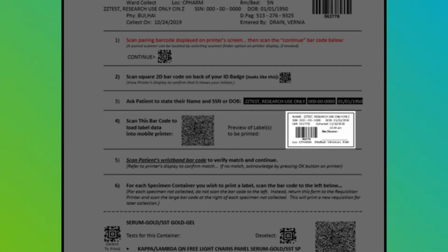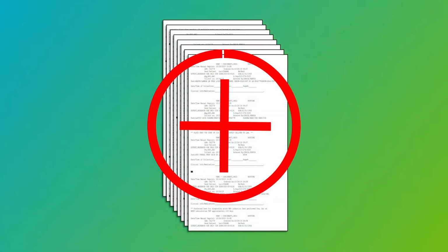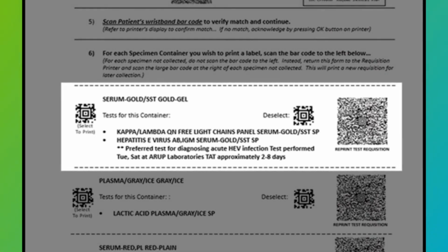This 2D barcode also contains the patient's ID number that is used to verify the patient's identity by scanning the wristband. This form also consolidates various specimen collection orders into groups based upon the specimen container type. One label will be printed for each container type collected. For example, the first container type shown here is for a tube with a gold top that will be used to collect a blood specimen for 2 tests to be performed. In this example, one test is for Kappa Lambda QN free light chains panel, and the other is for hepatitis E virus AB IgM serum.